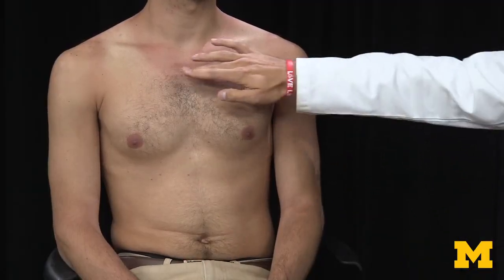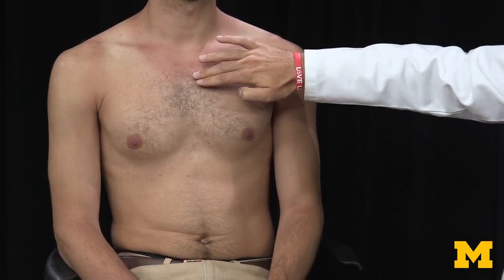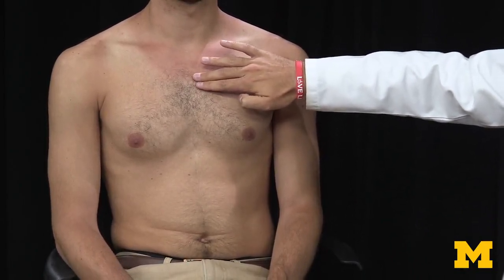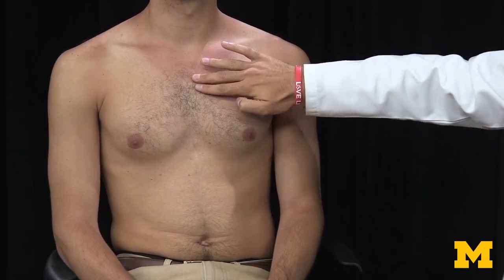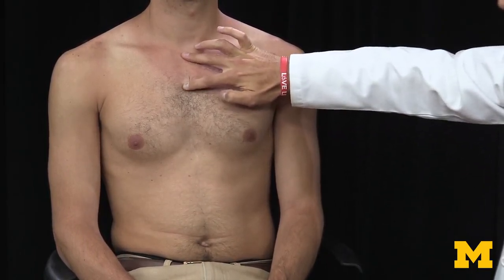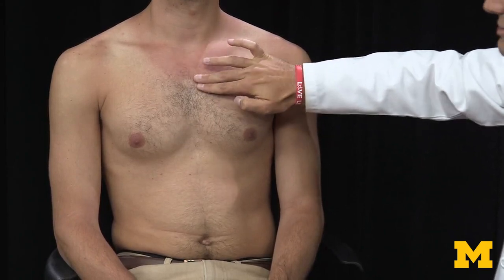The pulmonary valve is at the same height as the aortic but on the opposite side — the patient's left, at the second intercostal space on the left sternal border. I again locate the jugular notch, travel down to the sternal angle, and move immediately to the left. Like the aortic, this produces an S2-heavy sound: lub-DUB, lub-DUB.